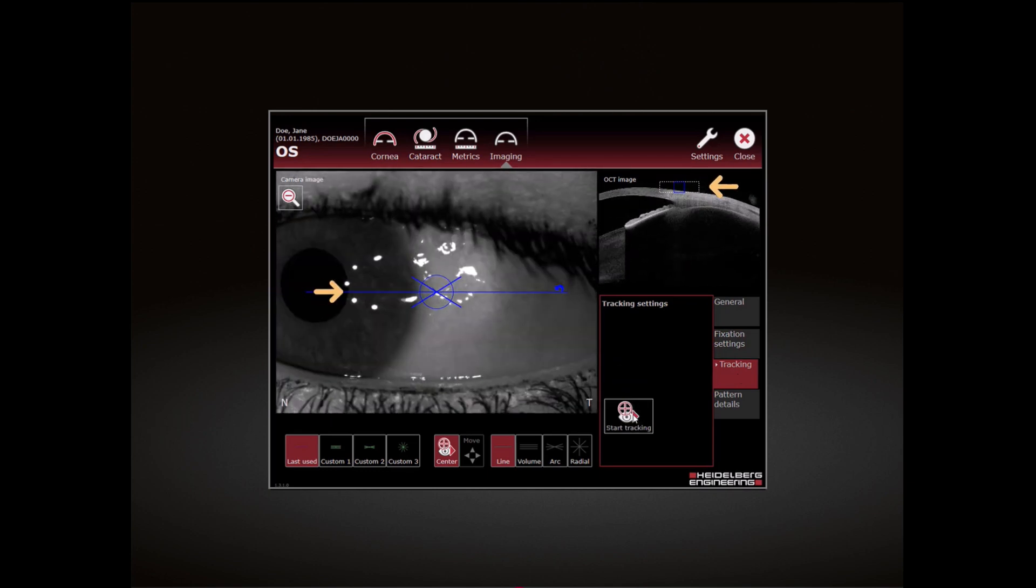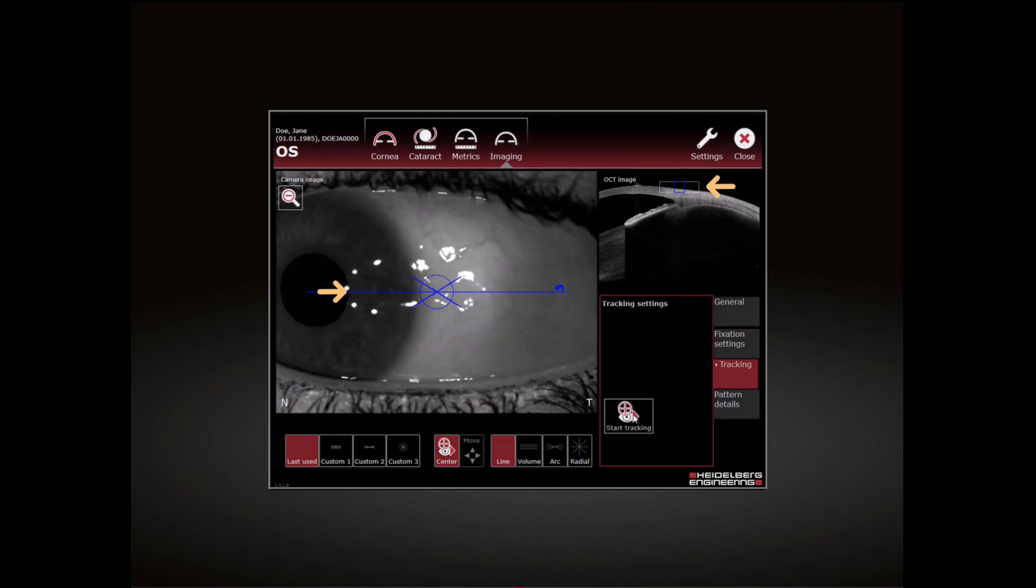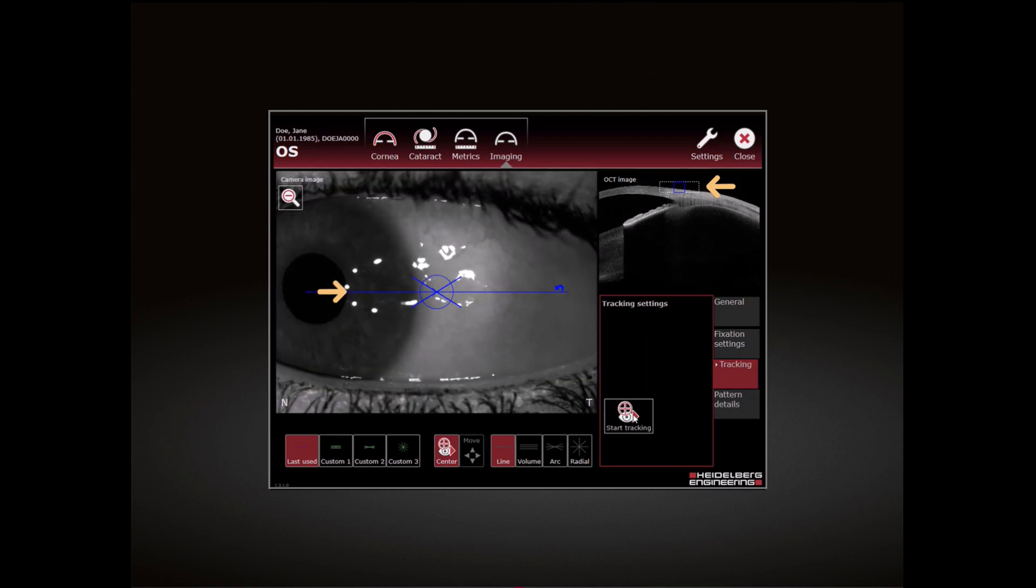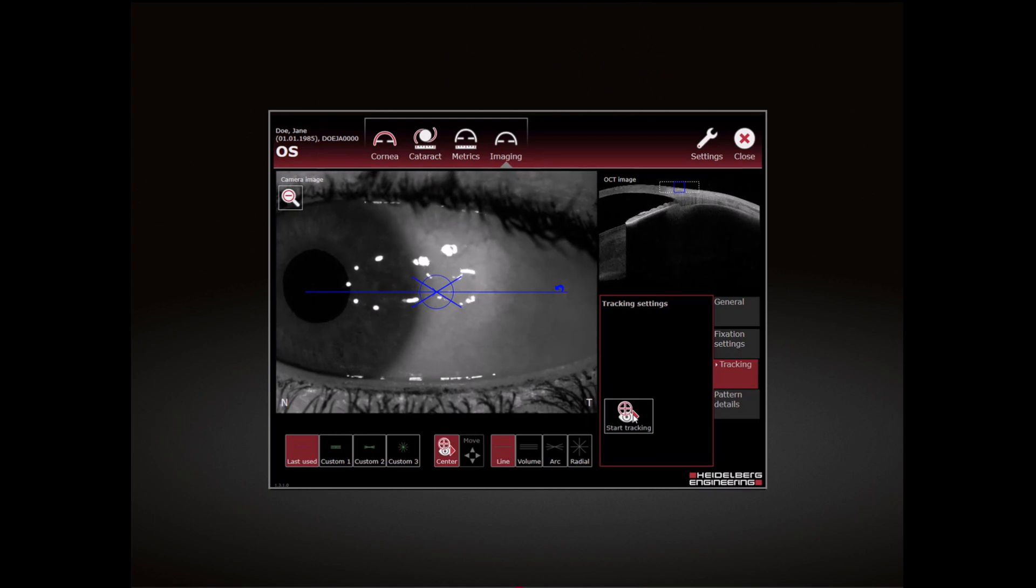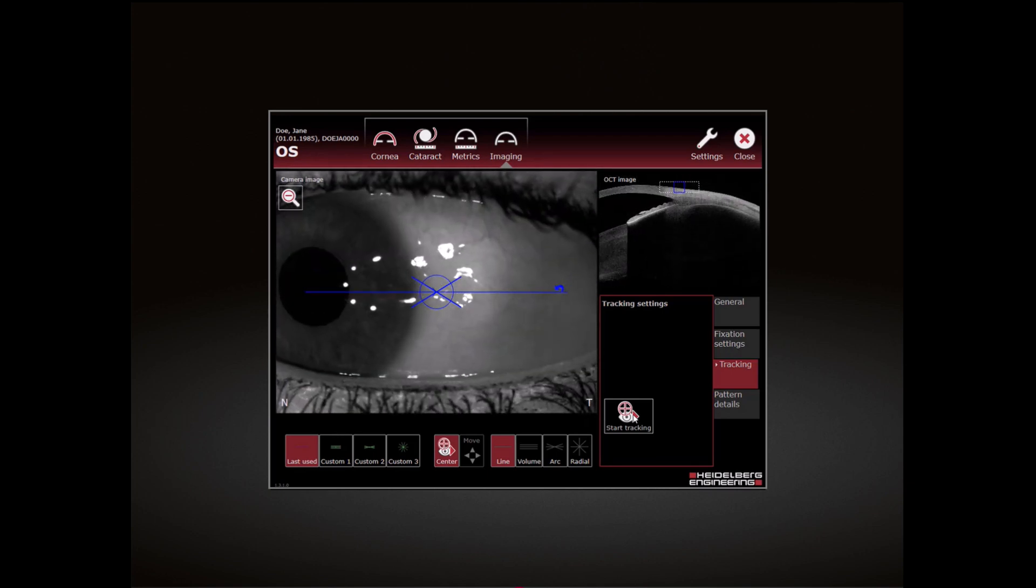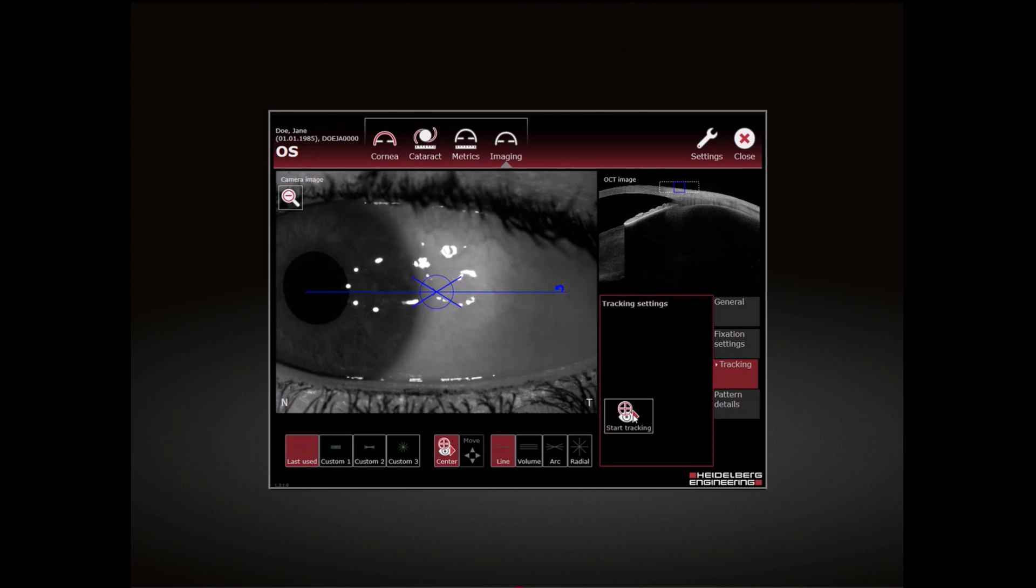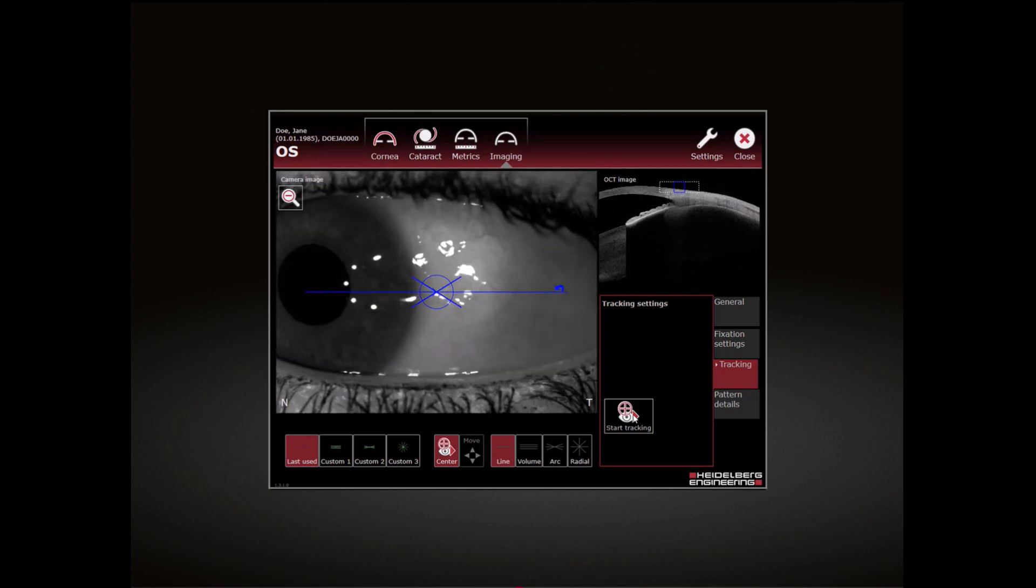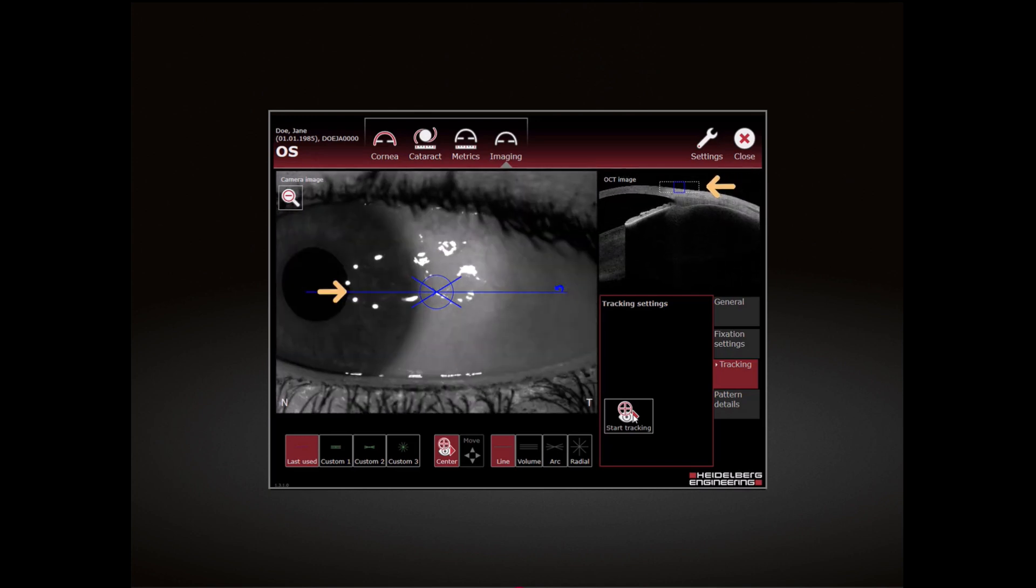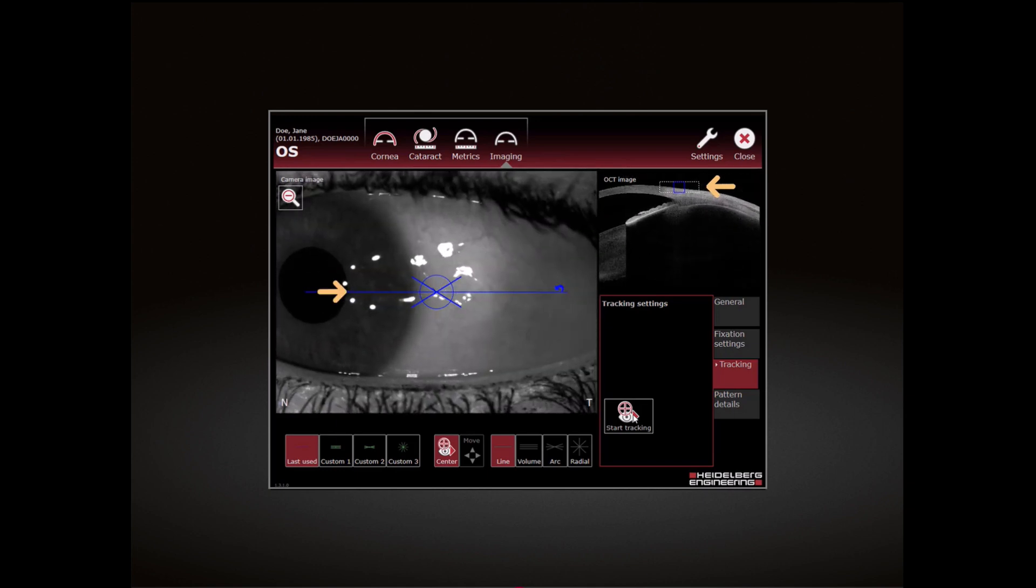The alignment markers on the camera image and OCT section image turn blue. Manually align the camera image so that the region of interest in the infrared camera image is centered within the blue scan pattern. Manually align the OCT section image so that the cornea or the sclera is within the dashed box.